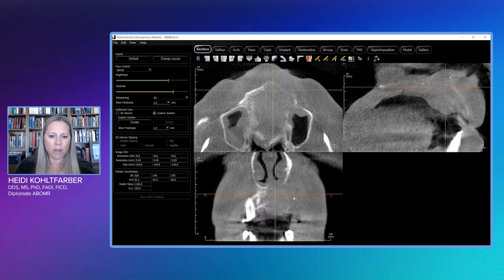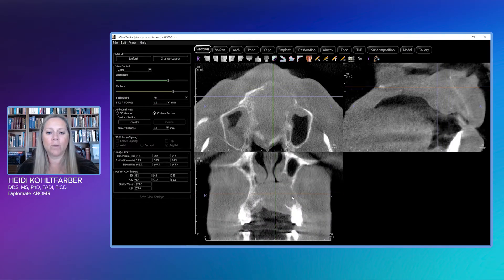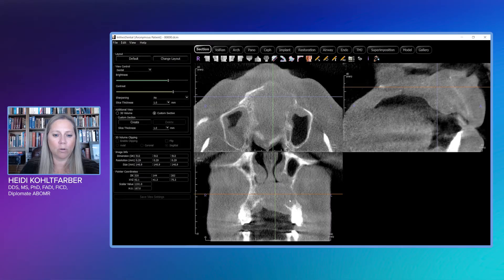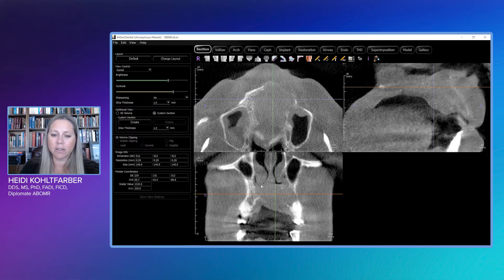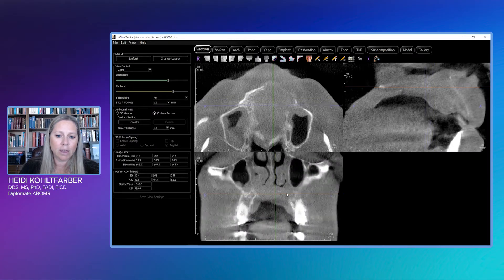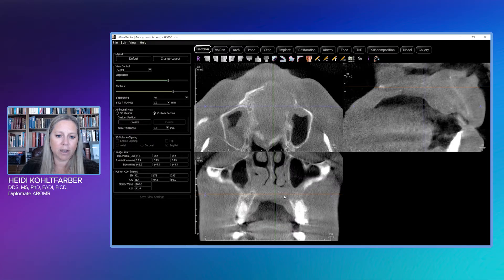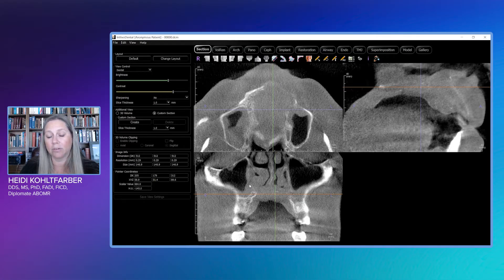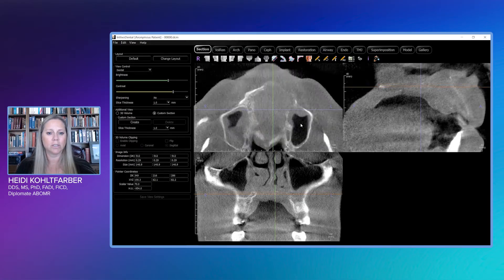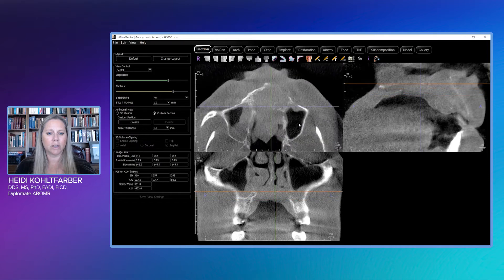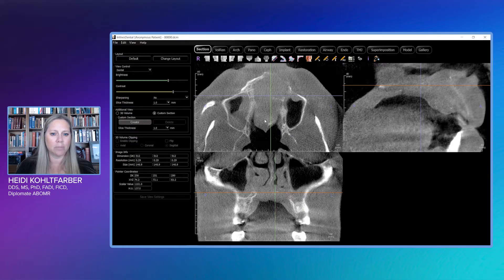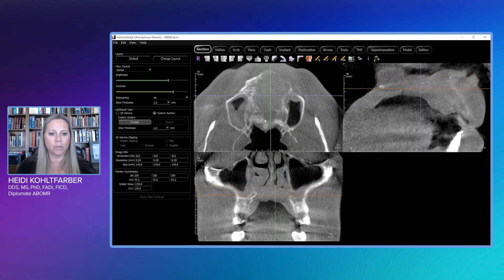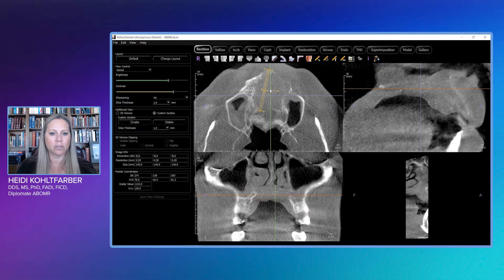We have erosion of the cortical borders in the palate and in the inferior aspect of the nasal fossa. We really don't see those cortical borders. It's extending into the antero-inferior aspect of the maxillary sinuses bilaterally. So this is quite a large lesion — very, very large. We also have a history of smoking with this patient, which will help us when talking about our differentials.